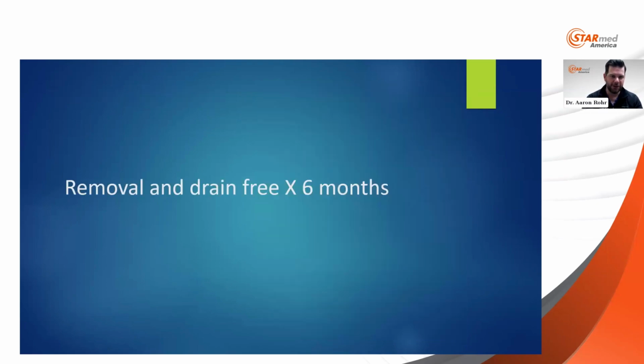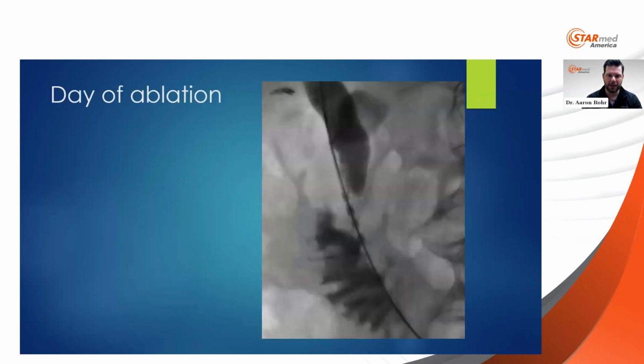This, no need to see the same thing, but removal and drain free. This is at a 6-month follow-up when I built this PowerPoint about the past 3 or 4 weeks. So they are completely drain independent after failed pretty much everything.